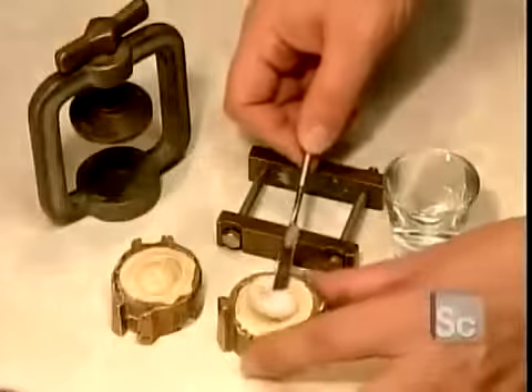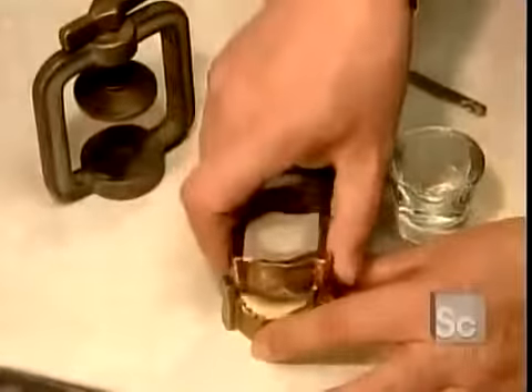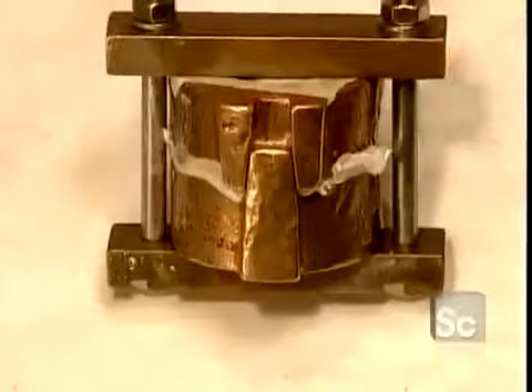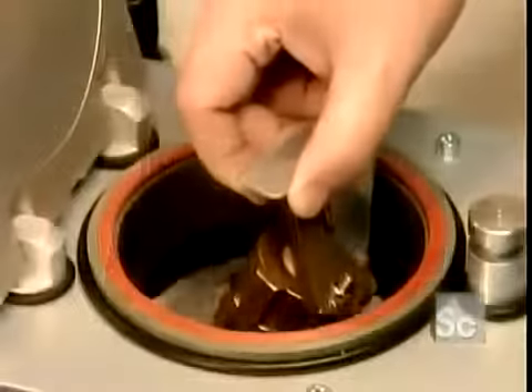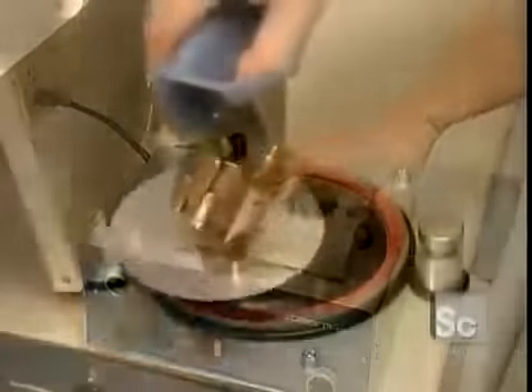Now they put a wad of acrylic plastic dough into the mold, lock the mold into a press, and submerge it in a high-pressure curing unit for 25 minutes. Then they cool the mold in cold water.